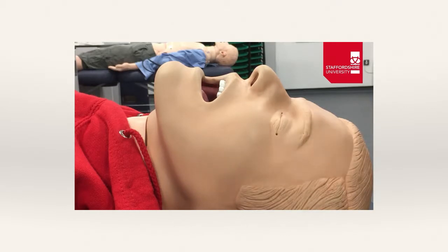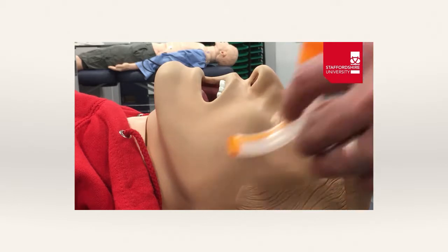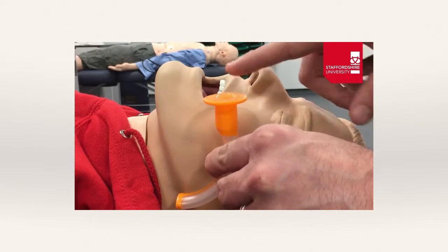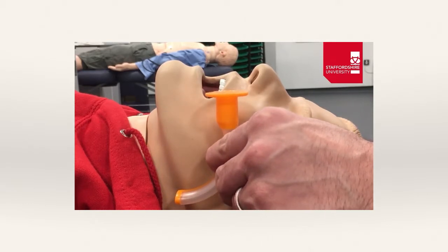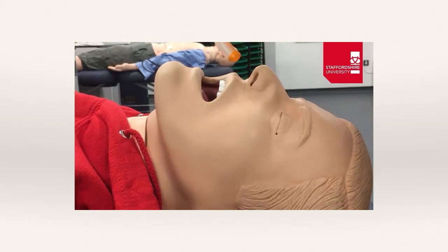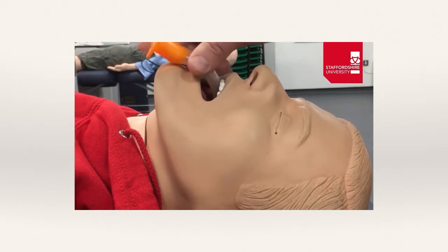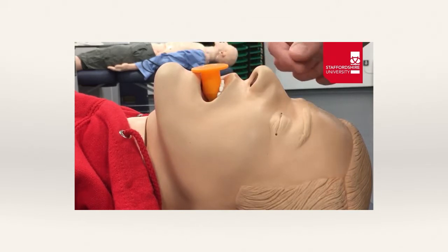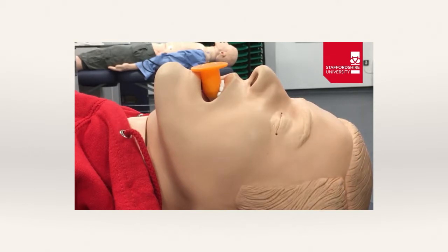We're going to have a look at oropharyngeal airway insertion. First, we need to size the OPA by placing the end against the angle of the patient's jaw and checking the level of the patient's incisors. To insert, we invert it — turn it upside down — and insert it into the patient's mouth against their hard palate, then rotate it around and locate it into the oropharynx. Invert, insert, rotate, and locate. That gives us a secure airway without the tongue flopping back against the soft palate.